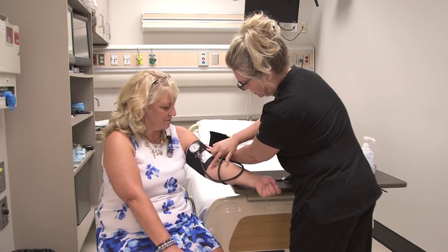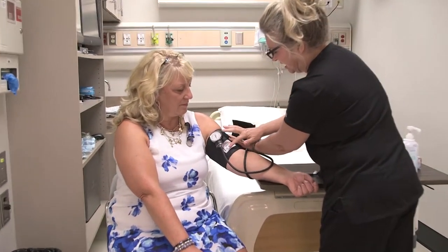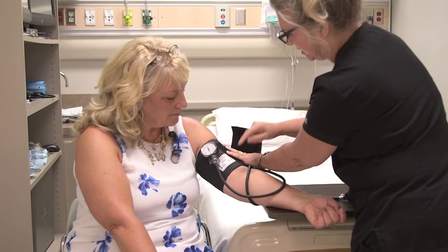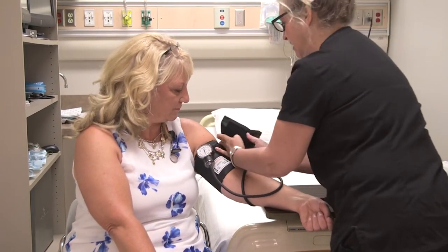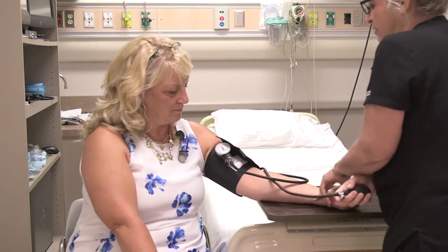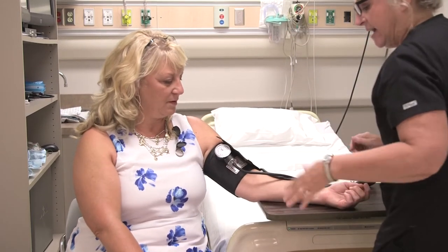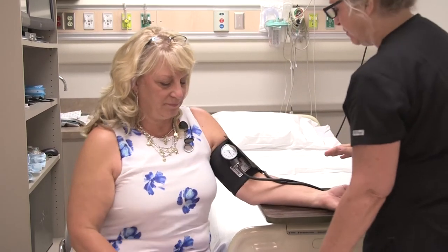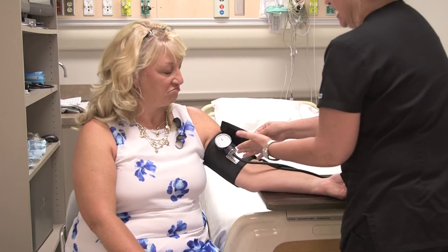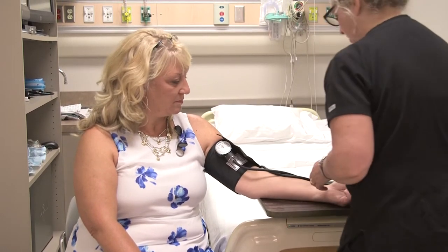You're going to want to be looking at the brachial artery, which is in the innermost part of the elbow. I am doing the blood pressure on the left arm, so I'm going to make sure that the brachial artery is right there about one inch above the antecubital space. The arm should be resting comfortably at heart level, and we also make sure that her feet are flat on the floor so that we get an accurate blood pressure.